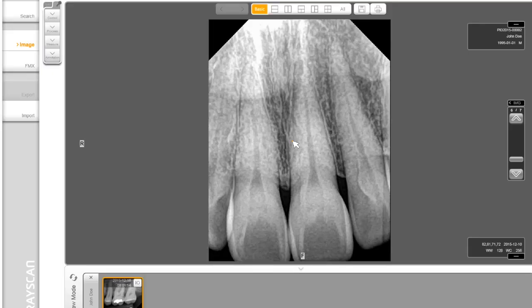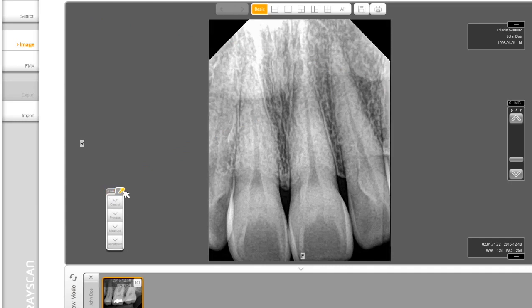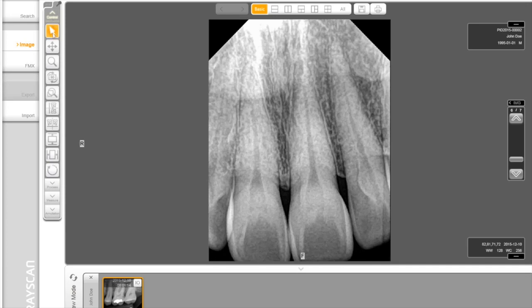Utilizing tools in Rio View. You have a series of tools on the left side. To expand or collapse any of the modules, simply click on their associated icons. If the toolbox is not in locked mode, it can be customized to display the desired toolbox option. In the top corner, you have tools in different sections. The first section is the Basic Control Manipulation Tool.